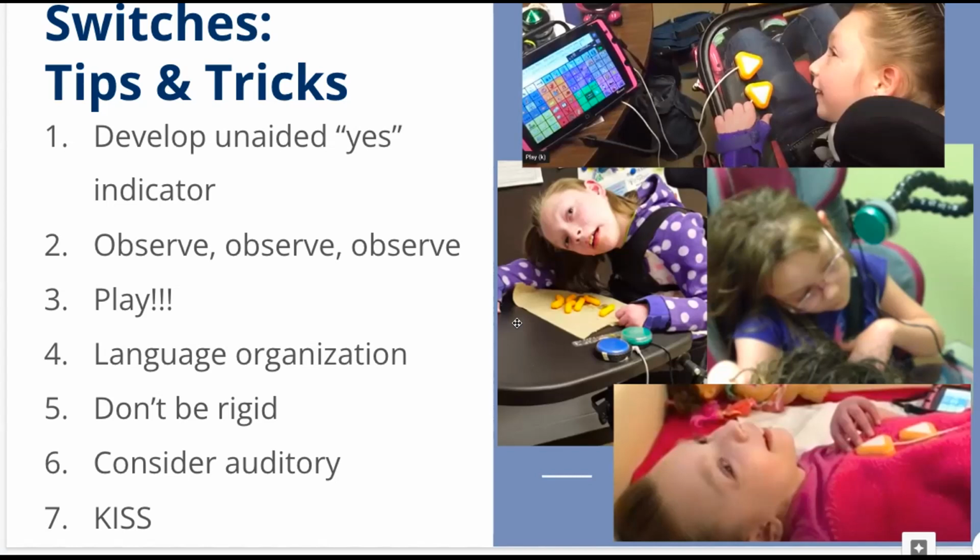That being said, don't be rigid. All the rules are "it depends." I'm sure someday I will run into an individual who breaks, well, I have run into almost all of my rules have been broken by somebody. And so, don't be rigid. Over my career I have had only 2 users who were single switch scanners who were faster as a single switch scanner than a 2-switch scanner. All the research says you are faster as a 2-switch scanner, but for these individuals, it was not true. And they were more efficient as single switch scanners.